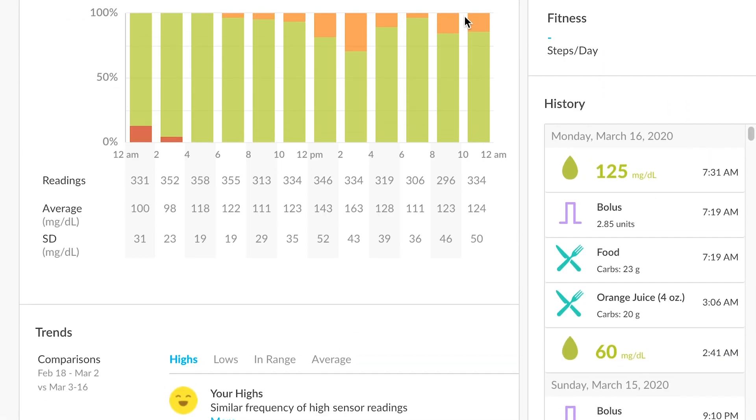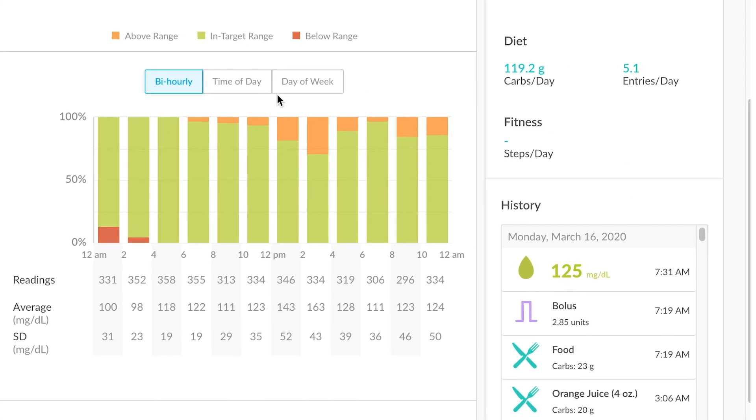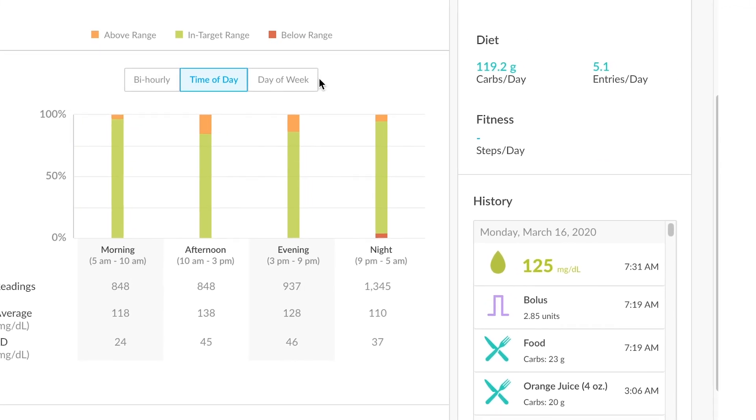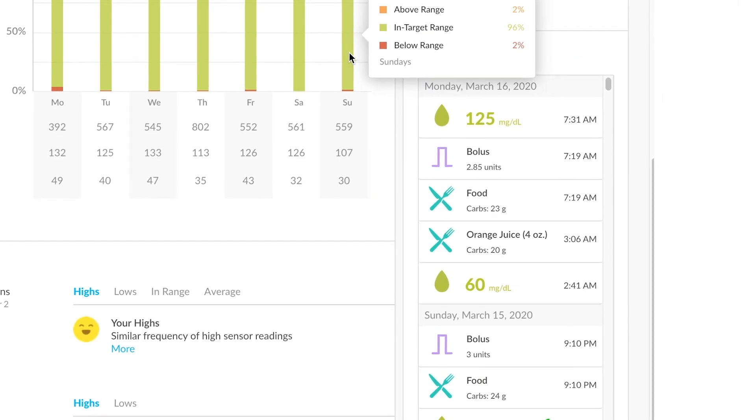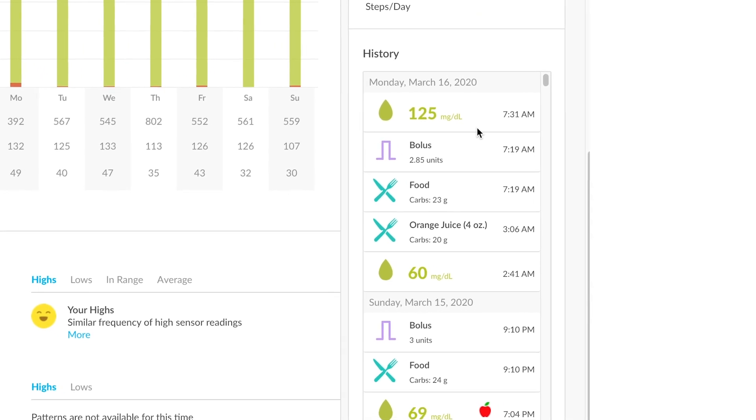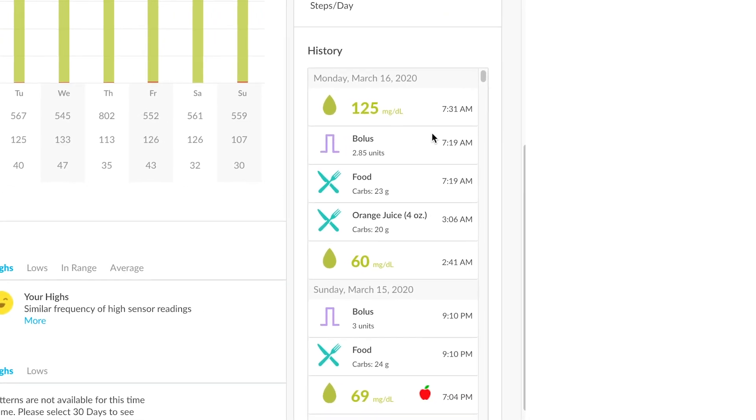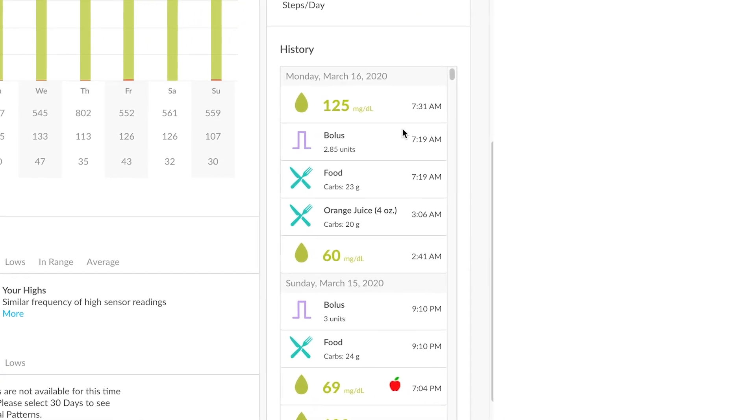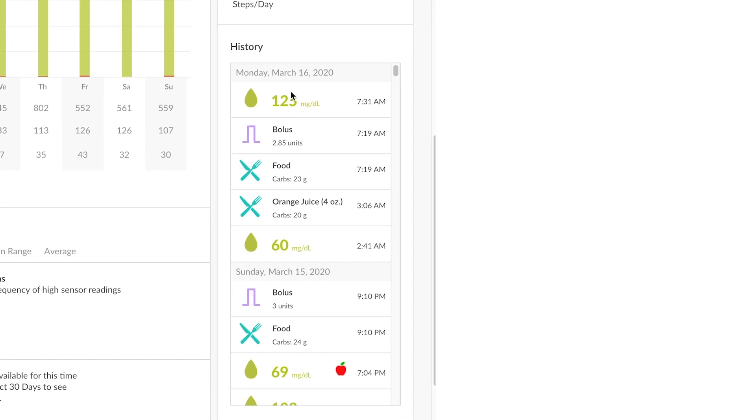Scrolling down, there's a lot of options. You can sort by time of day, day of week. Similarly, if you want to see more of a running tally of blood glucose values or foods that have been added, those are available to you in the history section in the lower right-hand corner.